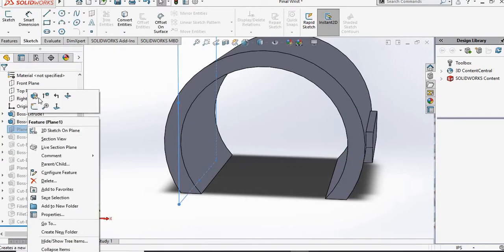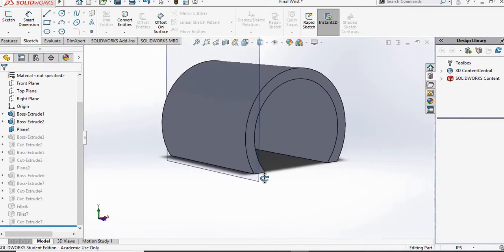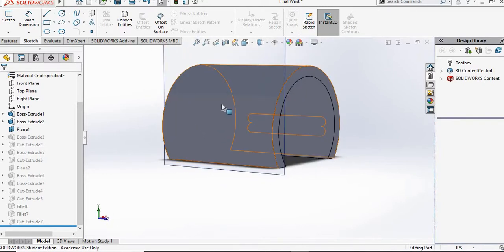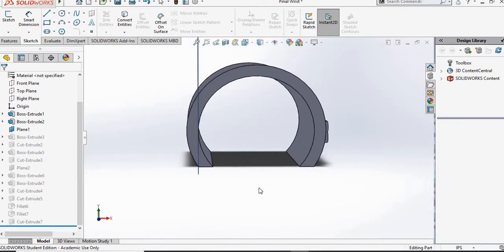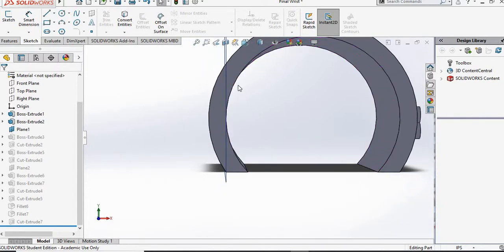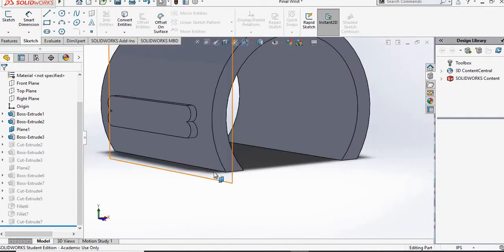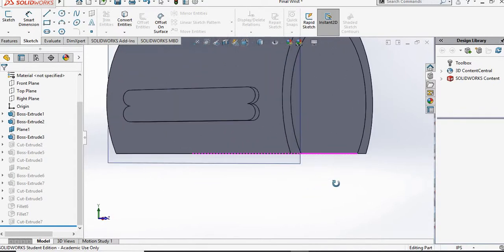Then I went ahead and created a reference plane, because you can't just do sketches on this circular surface. So I had to create a plane, and I used the edge of the inner arc as the reference point. And I went ahead and did the same thing on the opposite side and created these extrusions so that I can later create holes for our Velcro strap.